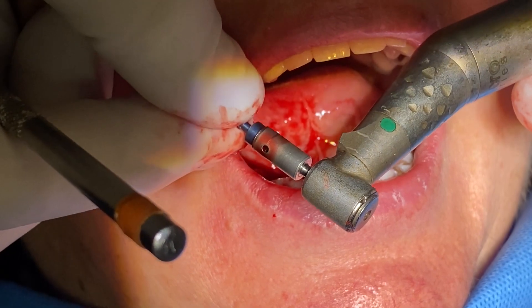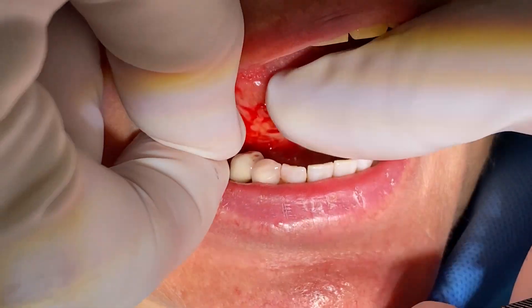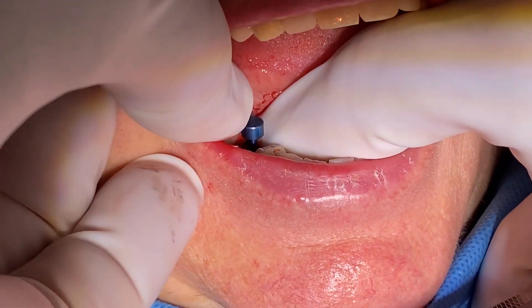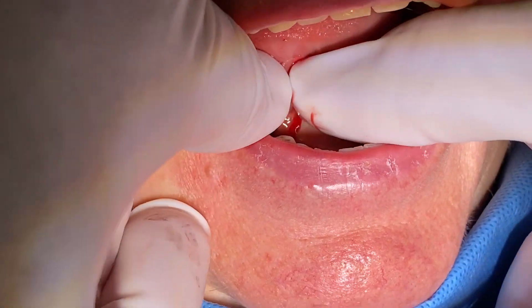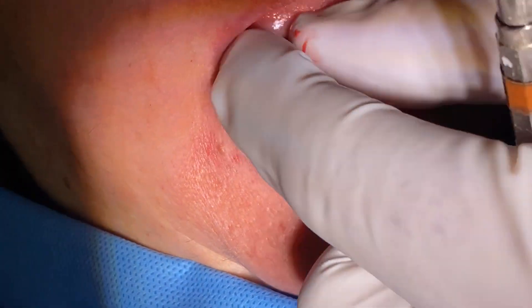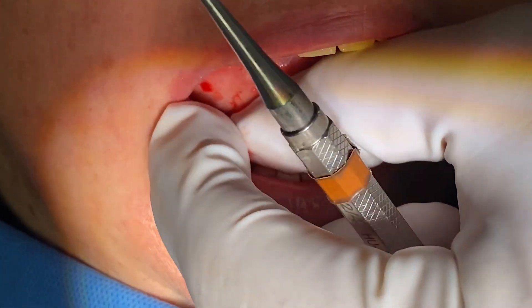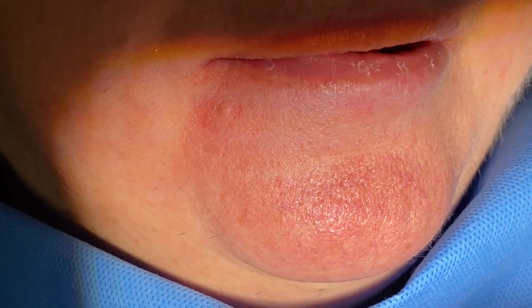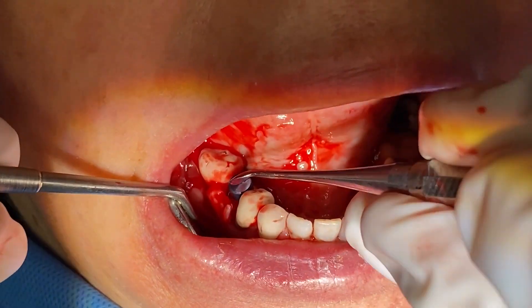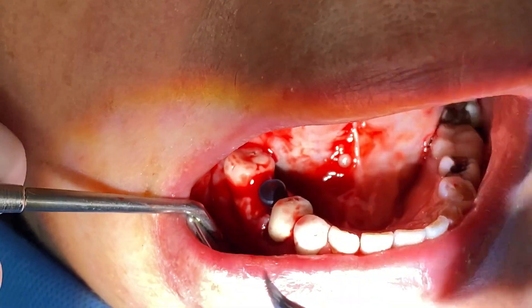We're going to use a hole cutter from Noble Biocare to prepare the osteotomy access. We'll put the disc in — this is a 5mm disc for doing a punch access. We're not going to punch the facial; it's very important to understand that. We're going to punch the lingual, so it's going to keep it out of the way when we're doing our guided surgery.